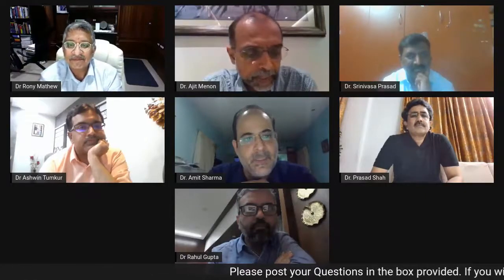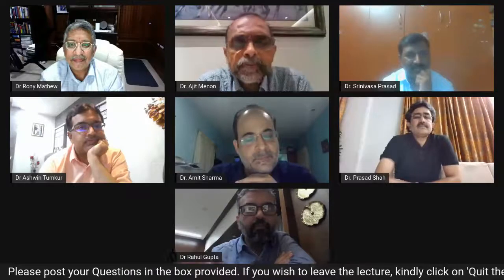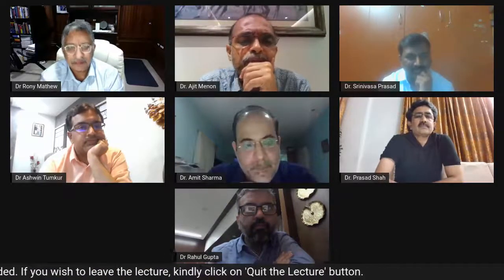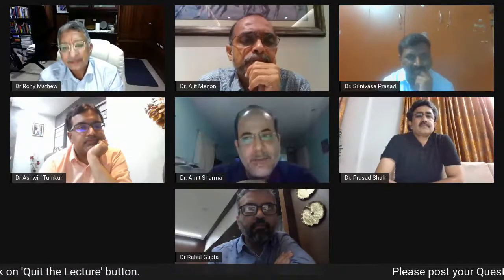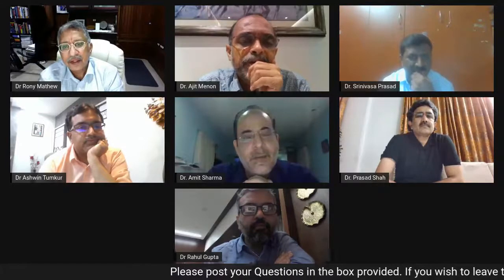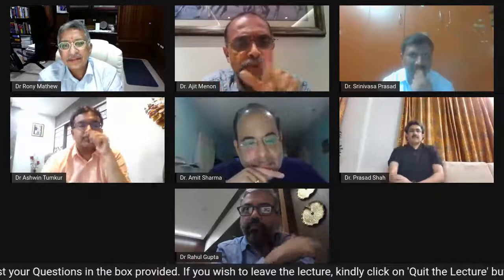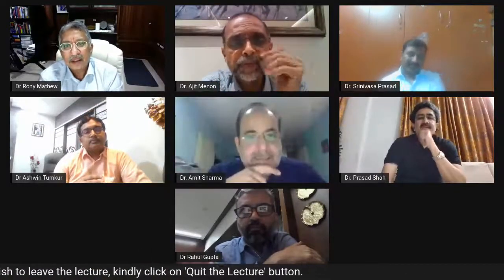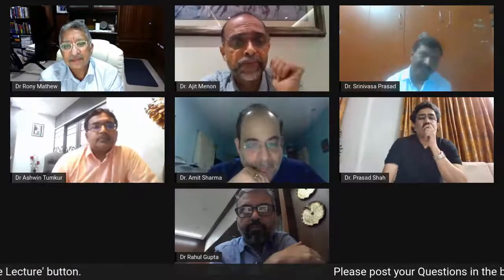Yeah. I think the only other thing was, I thought there was a little under-expansion at the distal end of the left main, even on the OCT images. Angiographically, yes. Angiographically and on the OCT. I mean, we didn't run the OCT to that segment, but if you look at the OCT cut at that area, there seemed to be a large plaque burden there, but a little under-expansion of the stent. Not a malapposition, but an under-expansion.